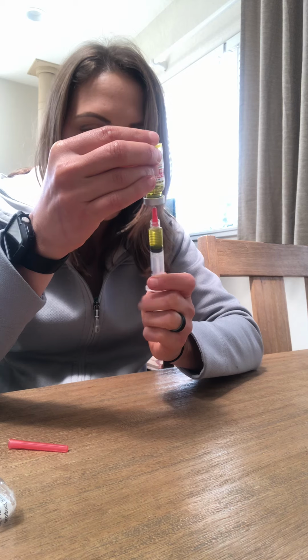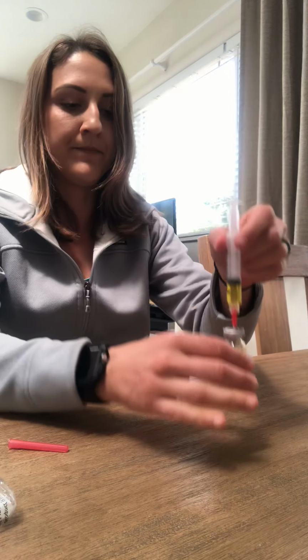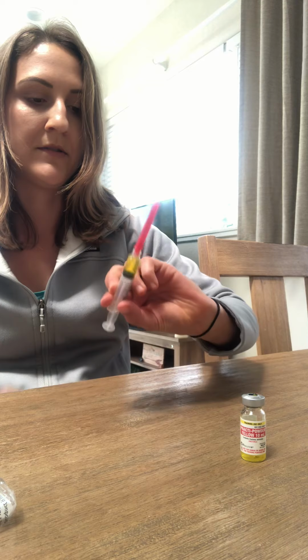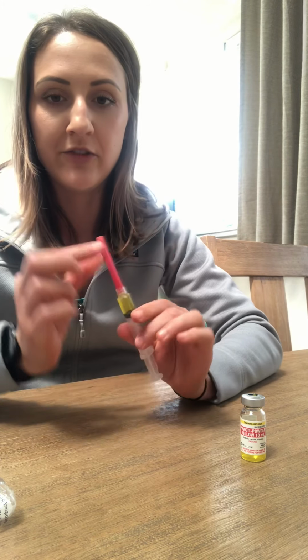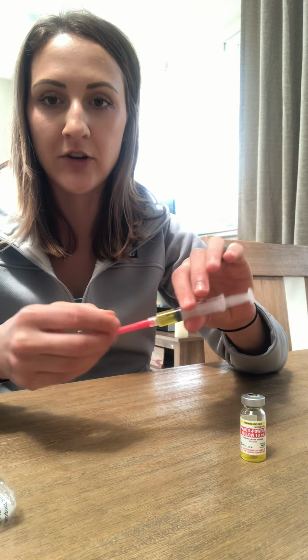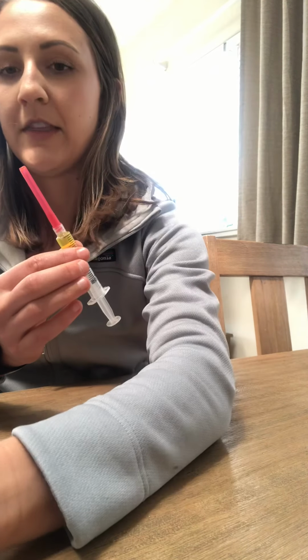Okay, so 2 mLs, expel any air bubbles, and reconfirm it's the correct volume. Reinvert, recap. And then if I was doing an IM injection or sub-Q injection, I would change the needle size for the kind of medication, the administration site, stuff like that.